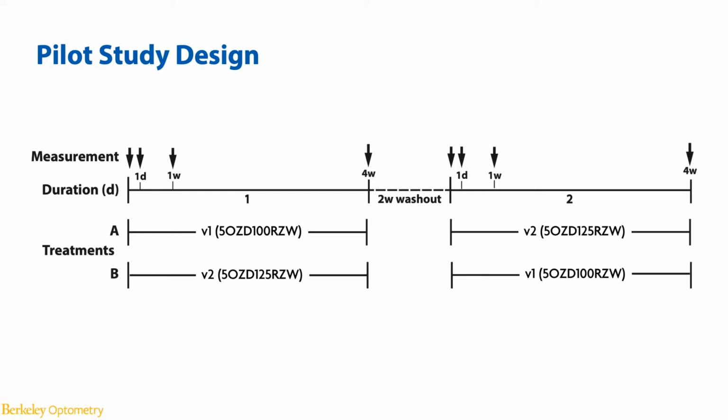At the end of the 4 weeks, we perform a complete washout. And during the second phase of the study, they swap the design interocularly. So the one eye wearing a V1 design now wears the other design. So this study has 2 significant advantages.